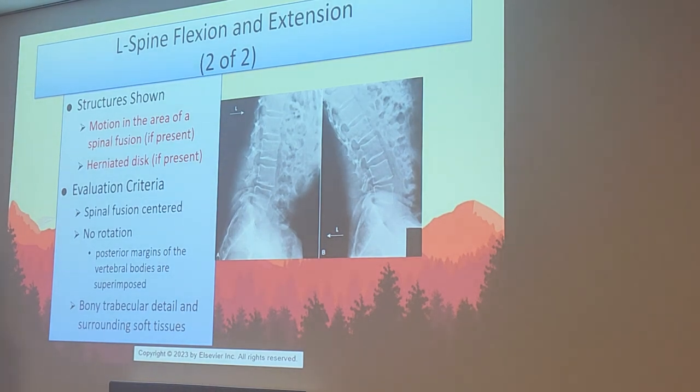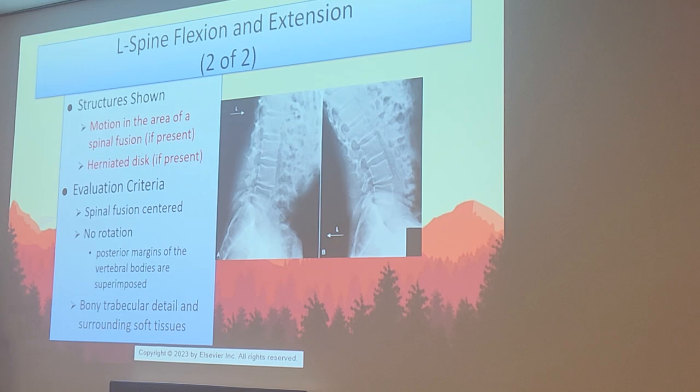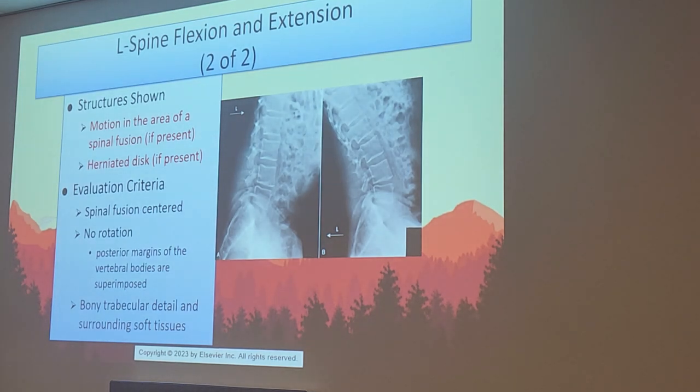So if they've had a spinal fusion, you want to center at that point, because that's what they want you to visualize. They'll indicate it all over. So you gotta read your orders, guys. Read the notes. It reveals quite a bit sometimes. It can also save you from x-raying the wrong parts.